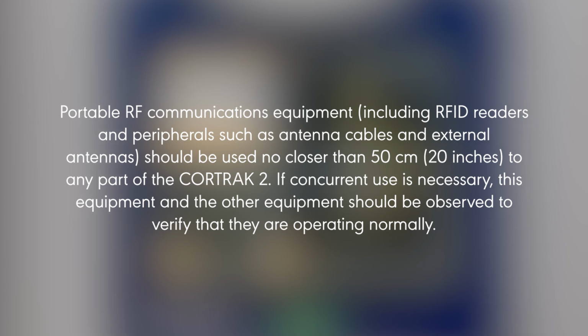If concurrent use is necessary, this equipment and the other equipment should be observed to verify that they are operating normally.